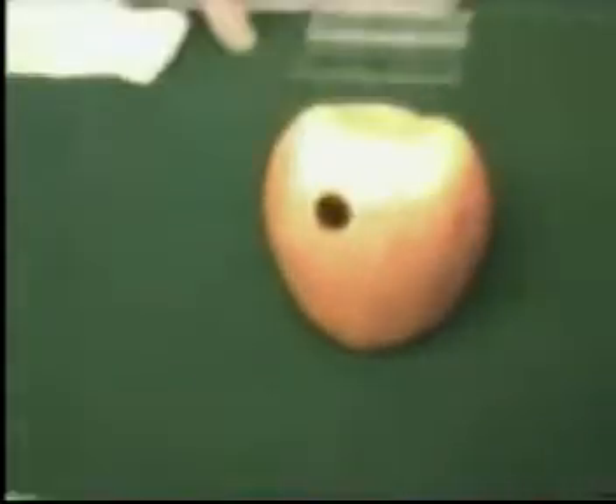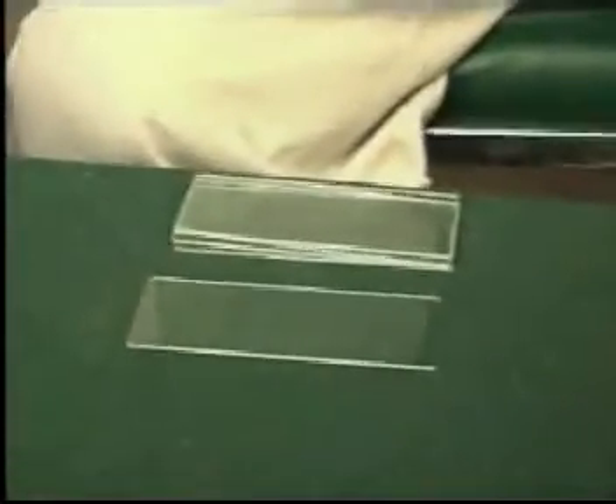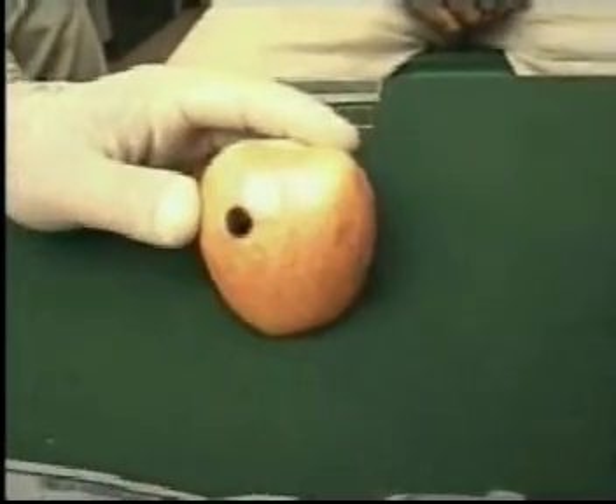How to perform an FNAC of a lesion. For this exercise we will need a 10 cc disposable syringe, glass slides, and a gauze piece or a spirit swab.